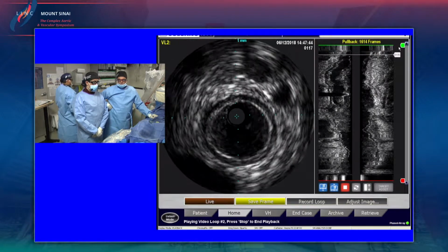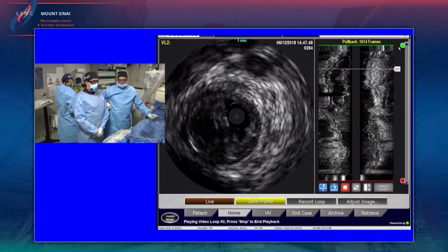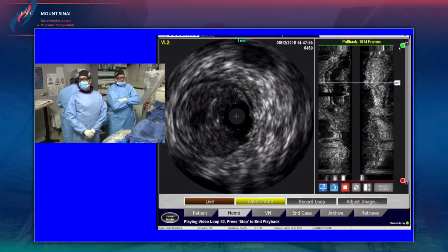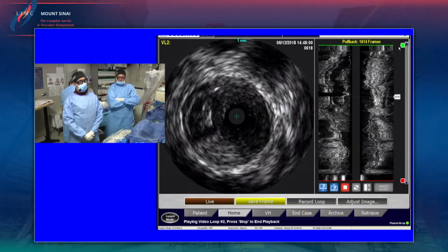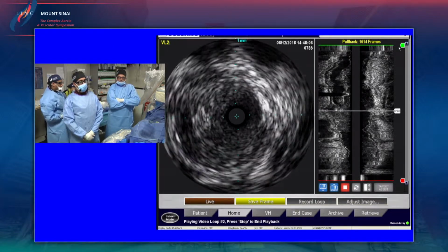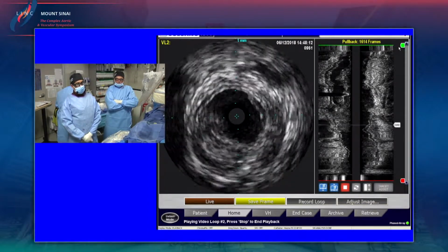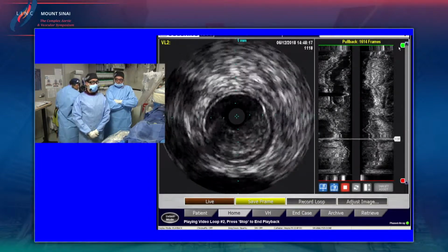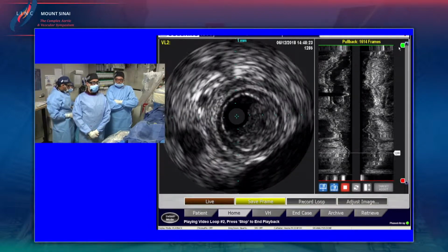So PK, this is Chris. The clinical scenario was, he's had claudication, but he's had attempts at the outside hospital. So this was not acute limb ischemia. This was claudication. Is that correct? Yes, absolutely. So I think you've got a mixed bag here. And maybe up front, if we had the Rotarex that they have in Europe that has thrombectomy and that, or the JetStream or laser kind of gets all three components, maybe that's another choice. I think now that you've already done the AngioJet and you've got a combination of plaque, dissection and everything, and he's still not an acute presentation, now it's a tough thing. And the other thing you could consider is ballooning now with distal protection, see what you get, and then decide from there.